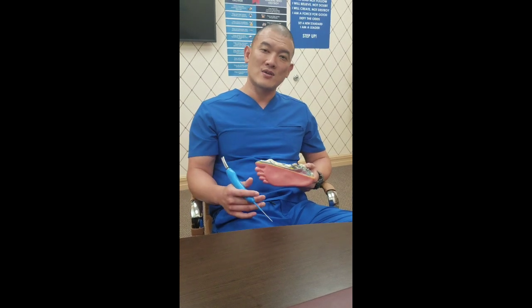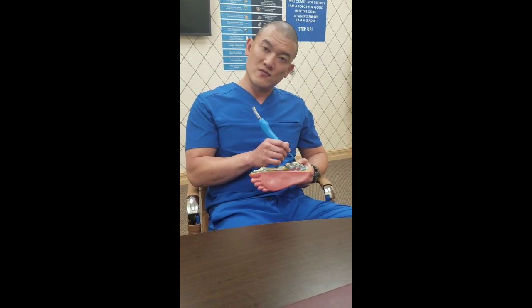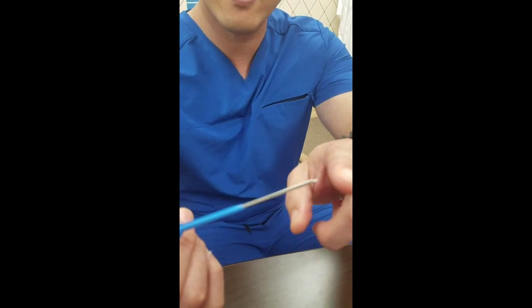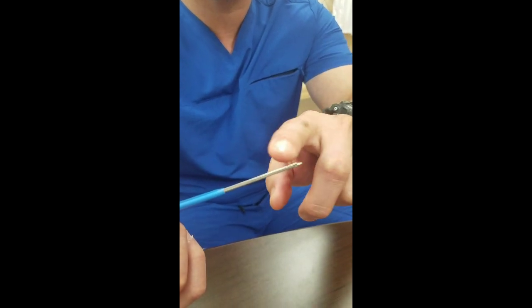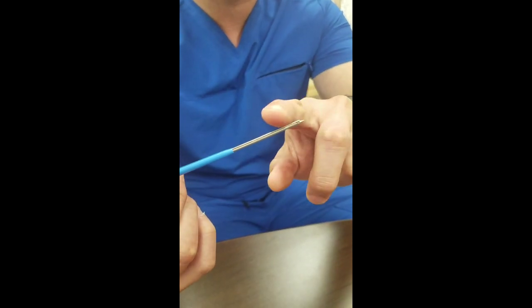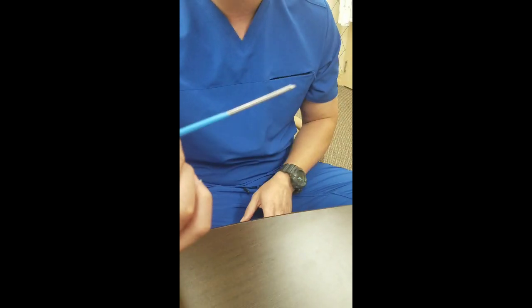So instead of cutting the plantar fascia, now we have technology with the use of ultrasound to selectively cut the inflamed bad tissue. What happens when you have plantar fasciitis? Inflammation, right? So you're going to get inflammatory tissue, and inflammatory tissue has more water content. So we use this little probe right here, looks like a little pen, little needle. Water shoots out the end, and bad tissue or inflamed tissue gets sucked into this little hole right here. So it's a constant stream of water coming out that breaks up all the bad scar tissue, and it gets sucked in here. That's the layman's term for how that works.